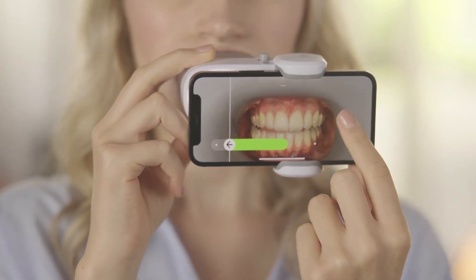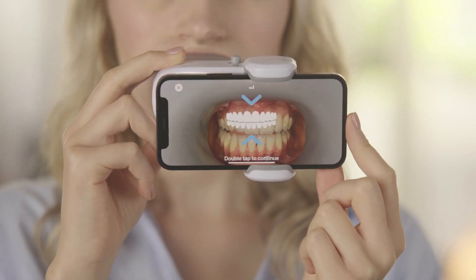If you need to restart the current step, simply press the restart button. For this next step, you'll have to keep your teeth slightly apart and scan side to side. Double tap to continue.